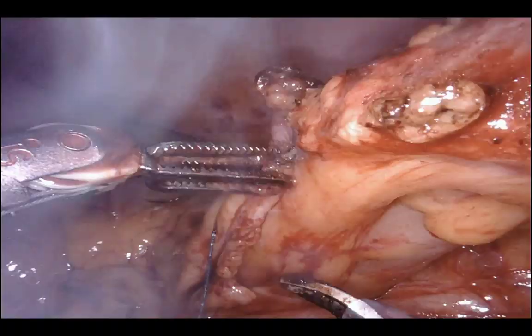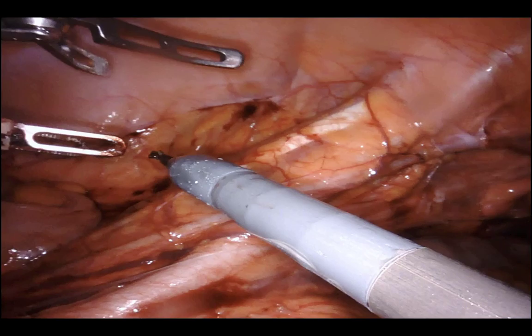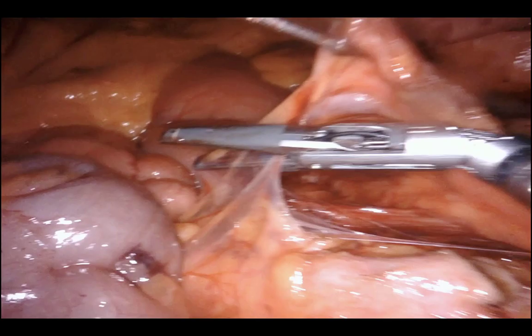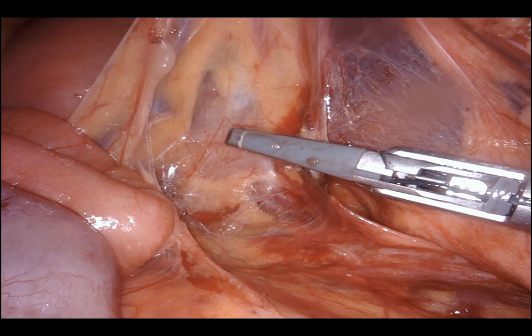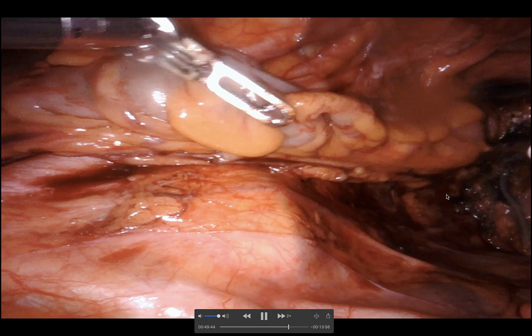Making sure everything is hemostatic and checking orientation. I cut the suture and hand it to my assistant. The specimen is placed in the right lower quadrant. My assistant goes transanal and starts dilatation with EEA sizers. Checking the IMA anatomy and confirming we have plenty of mesenteric length — which we do, given the extensive rectal mobilization.